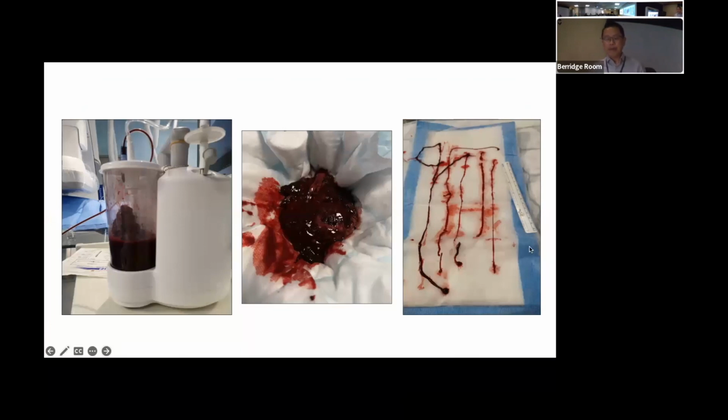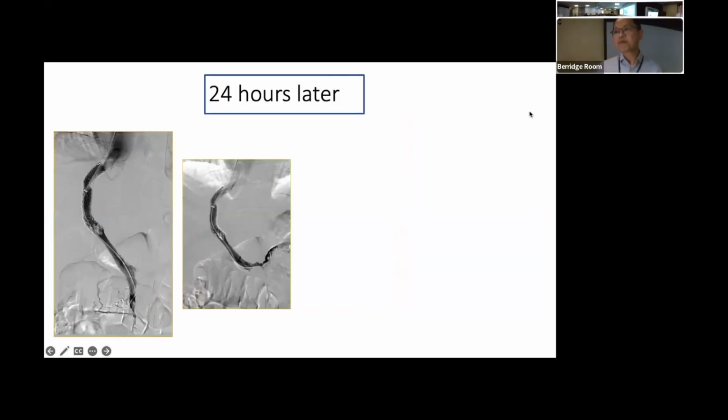And this patient will form clot as he was doing the procedure. They are pretty much procoagulant, procoagulopathic. So the more clot you suck out, the more clot it forms, and it continues the vicious cycle. So you do need to have some degree of thrombolytic agent and anticoagulation to help with the procedure.